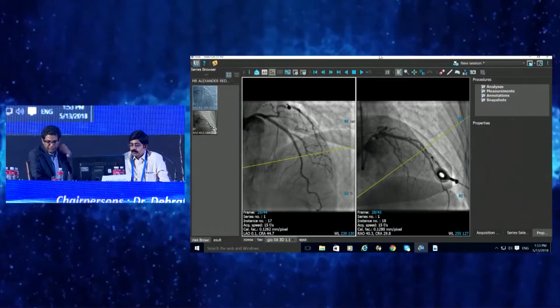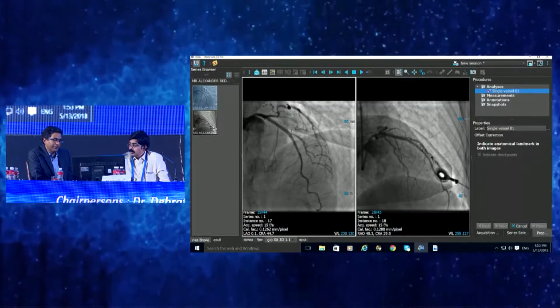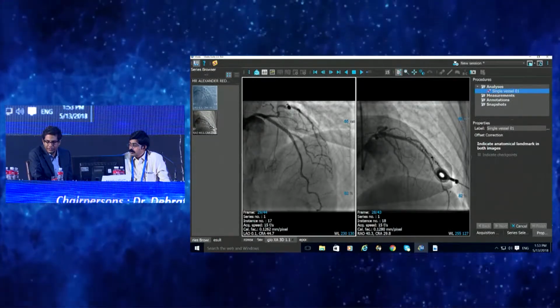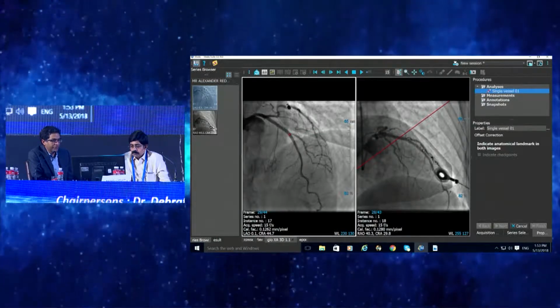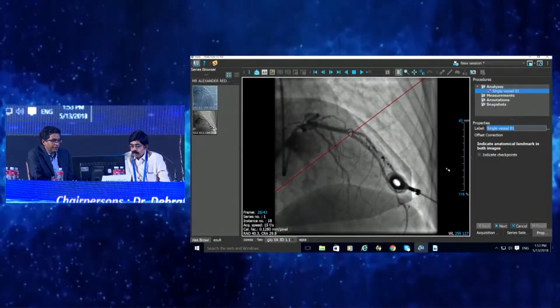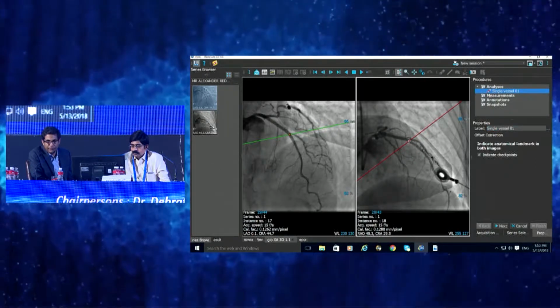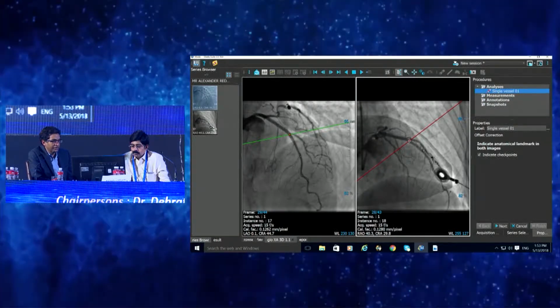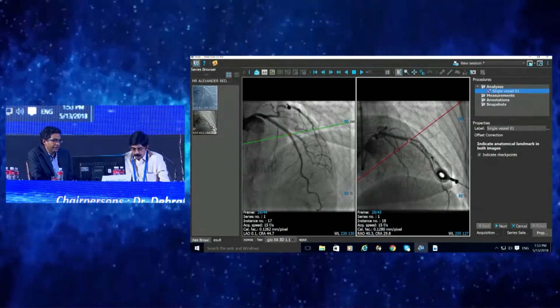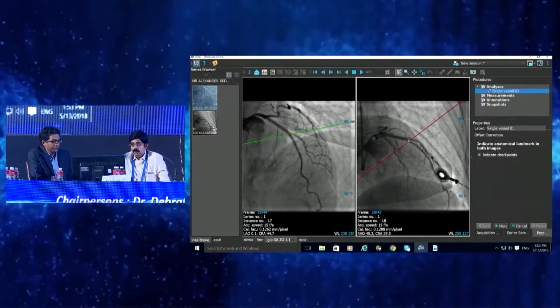The system has to be bought by each cath lab, and it has to be installed. It is an extra monitor or workstation, right? Yes. And so you need to have enough knowledge about that workstation as well. There are a couple of companies that are looking at this very closely, and one is Medis system, the other one is CathWorks, which are both available in Europe.